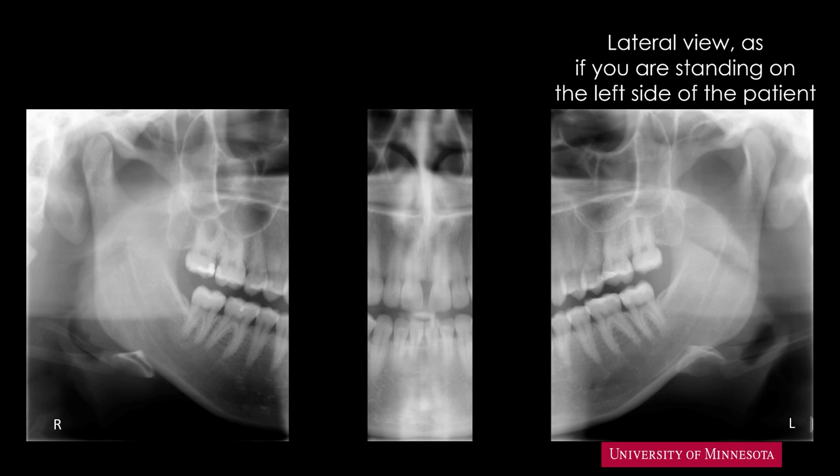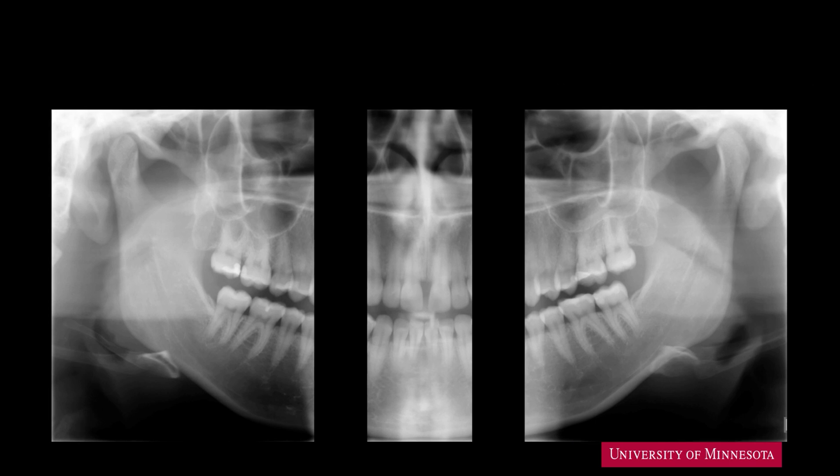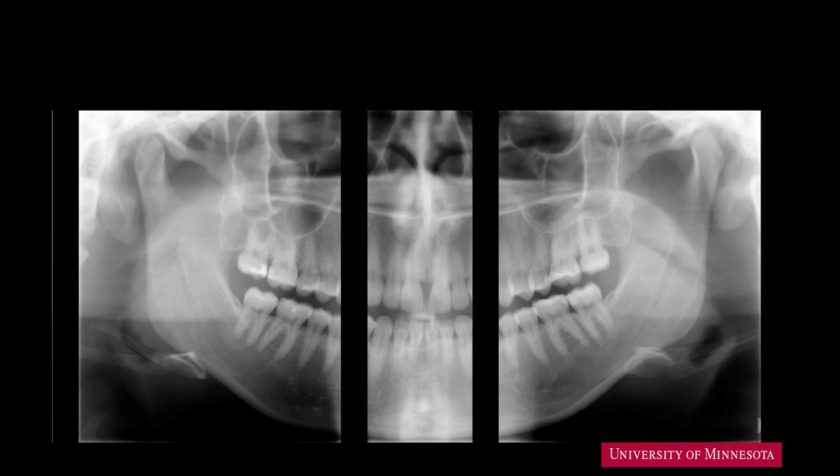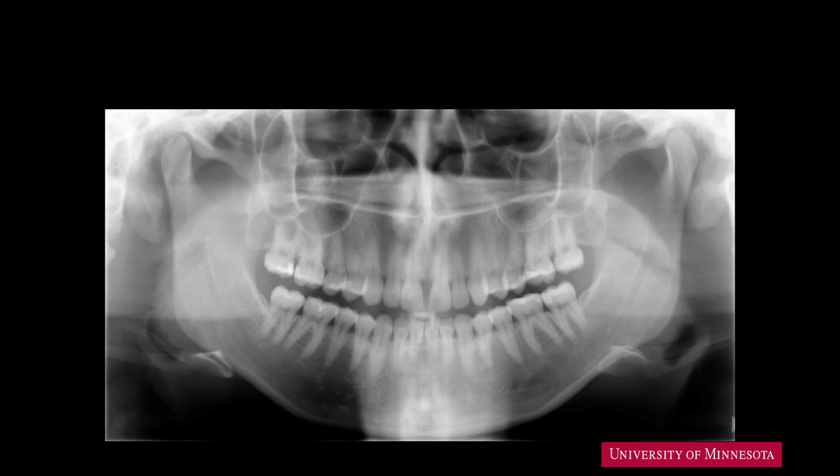Some other structures, such as the hyoid, may be recorded twice. If we stitch the three images into one, we get a panoramic presentation as seen here. Let's use this image to learn several critical radiographic landmarks.